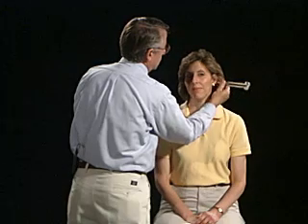And then the Rinne — we're placing it back on the mastoid. Can you hear that? Can you tell me when you can no longer hear it? You can hear it now. Yes. We should do the same thing for the other side, but another way to screen with the Rinne is to ask the patient which is loudest: number one at the mastoid, or number two, air conduction. Number two. And that's the correct answer, so that would be the normal response.